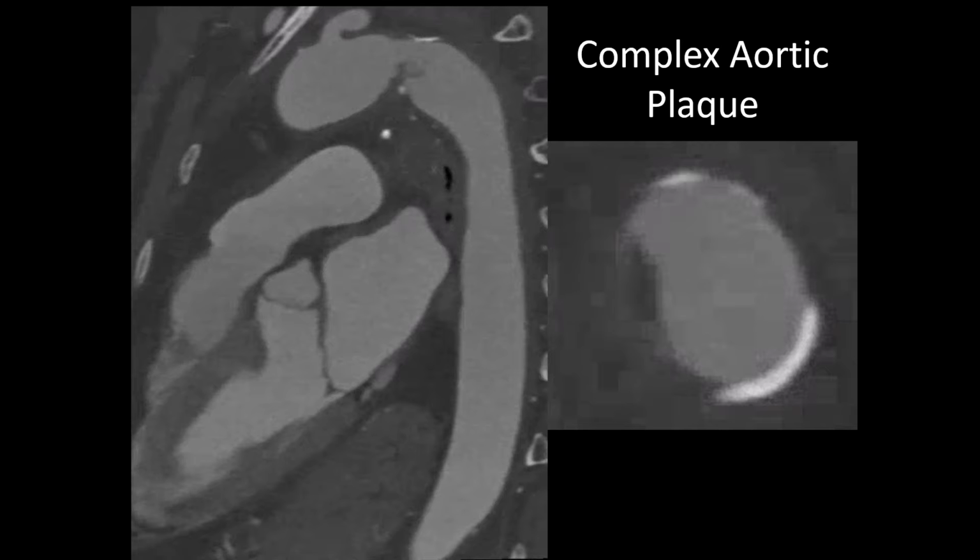Again, this is a frail little 81-year-old lady who only has one lung. She's on chronic oxygen, and I don't think very many people want to do anything aggressive with her at this point. But yeah, that would be a strong indication for some sort of surgical intervention procedure. Is the site where the thrombus is in the aorta at the ligamentum arteriosum? Is there a remnant there that created that? It's possible. That is near the location.